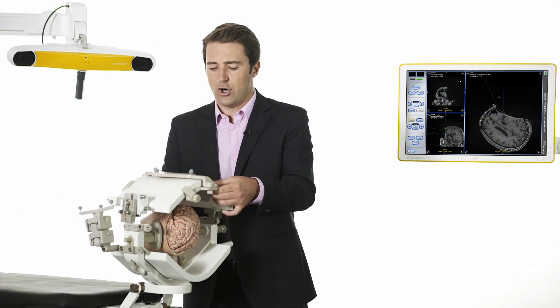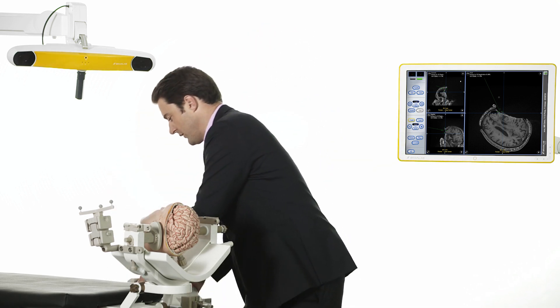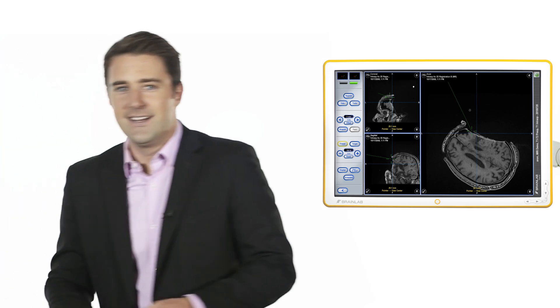To continue surgery, the coil and matrix can be removed and the data is ready for navigation.